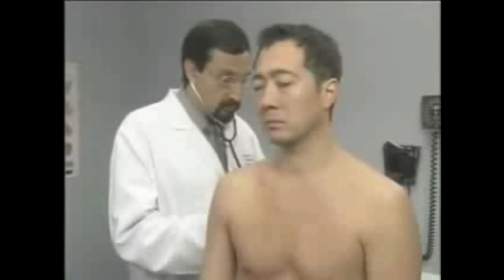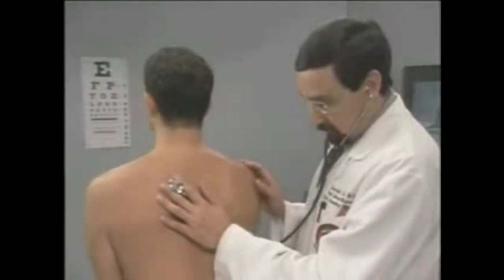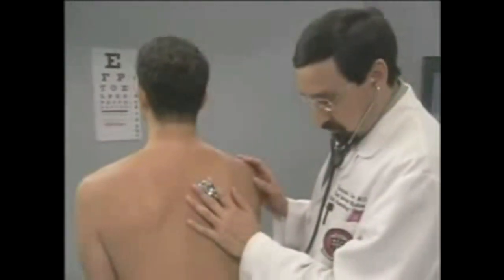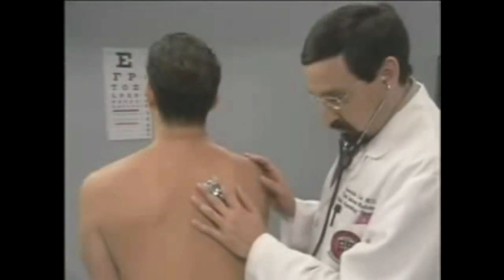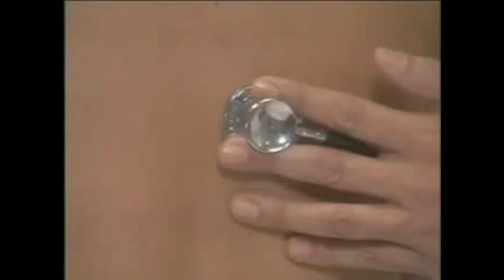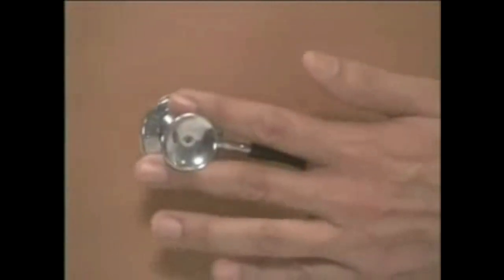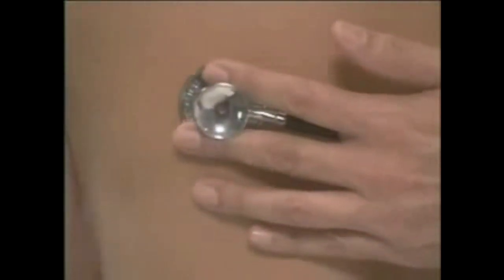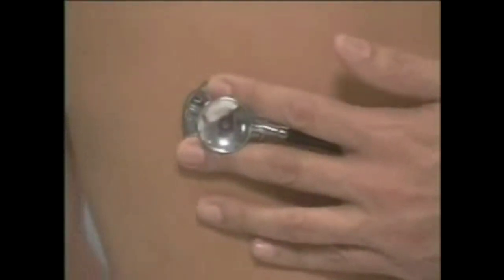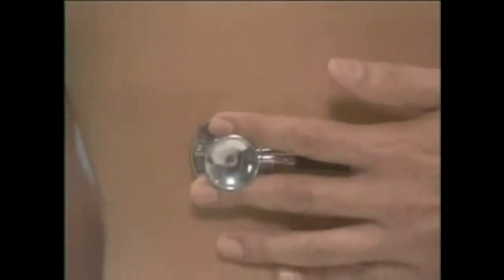To auscultate the posterior thorax, use the diaphragm of the stethoscope. Begin at the apices and proceed downward, moving systematically from side to side, again in a ladder pattern, comparing breath sounds in symmetrical areas. Listen to the duration, pitch, and intensity of the inspiratory and expiratory sounds. Decide what type of breath sounds you are hearing, and note any added sounds. Listen to at least one entire breathing cycle at each location.